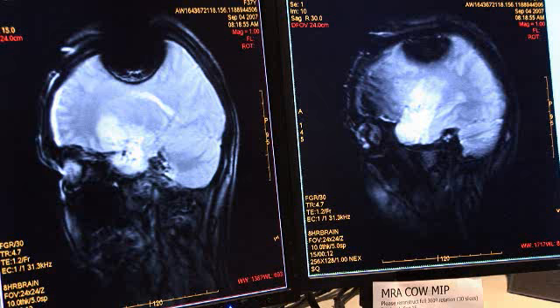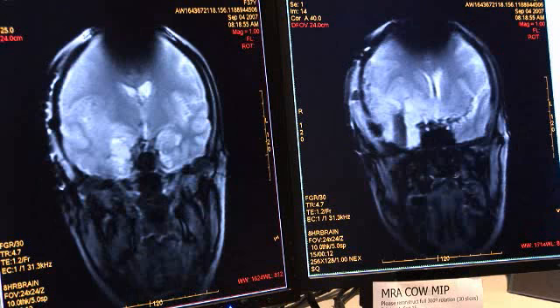Some will be a patient safety issue in terms of heating, or some devices will move if they're not implanted into bone or muscle tissue or have any fibrous tissue around them. Other things are just things like knee implants or bone implants, and most of the time they'll be okay, but we need to know about them. They'll cause some artefact on the images, but they won't necessarily impair the whole examination.